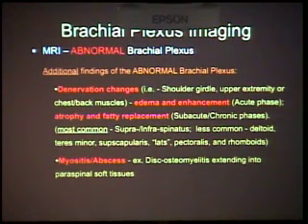Not just looking at the nerves, look at the structures around it. If you have atrophy of one side, one muscle group compared to the other side on your coronal images, that can be a telltale sign of what's going on. Look for fatty replacement of those muscles in the later phases. And then myositis and abscess. Look at your post-contrast images, not just enhancement of the nerves, but I've seen a case where there was disc osteomyelitis extending into the adjacent musculature and soft tissues. So that's another thing that you might not be looking for, or if you're not looking carefully, you may miss it.